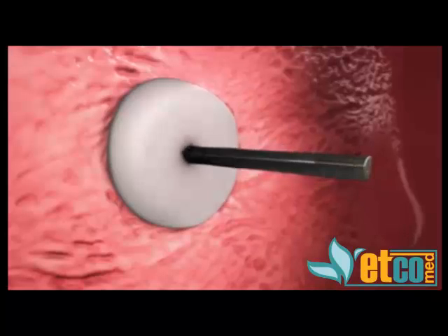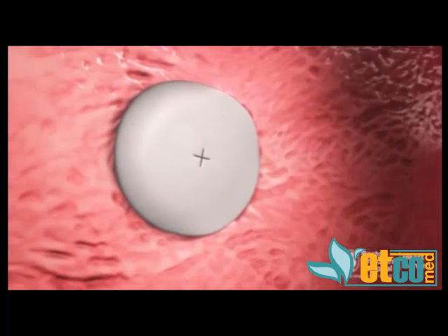Finally, the clinician deflates the balloons and removes the catheter, leaving behind the biodegradable patch.